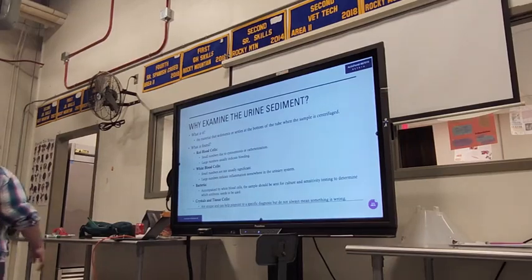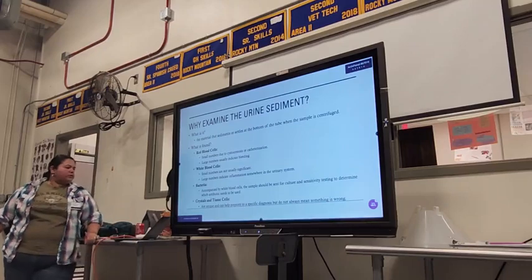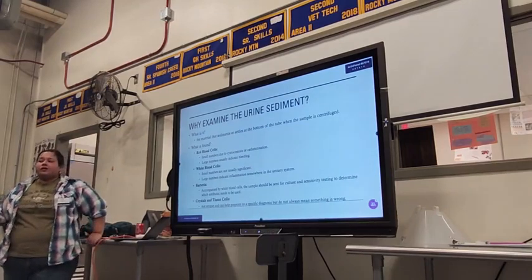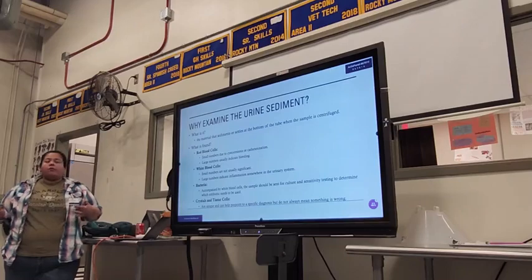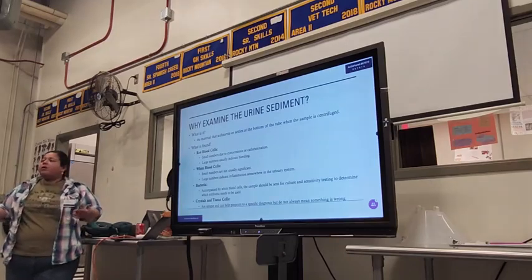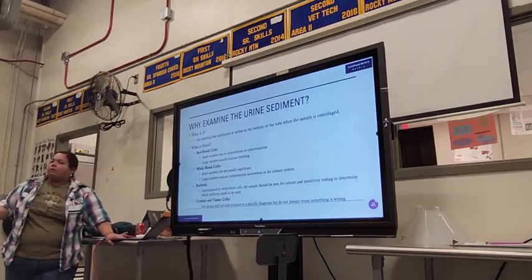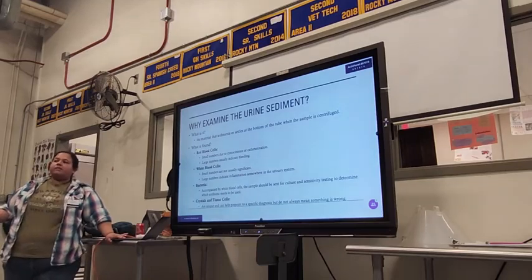All right. If you see crystals or tissue cells, these are unique, and they can help pinpoint a specific diagnosis of what is wrong with the patient, whether the renal system or anything else. How does that work, the crystal cell? I'll find some photos for you.